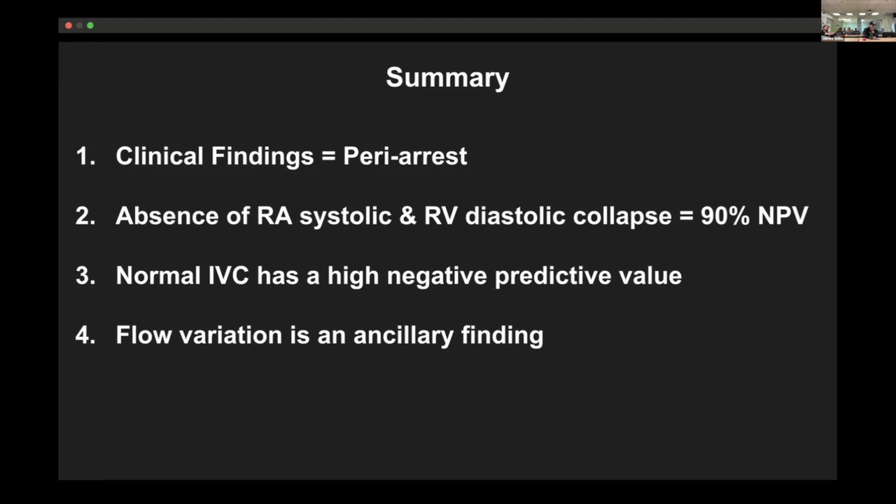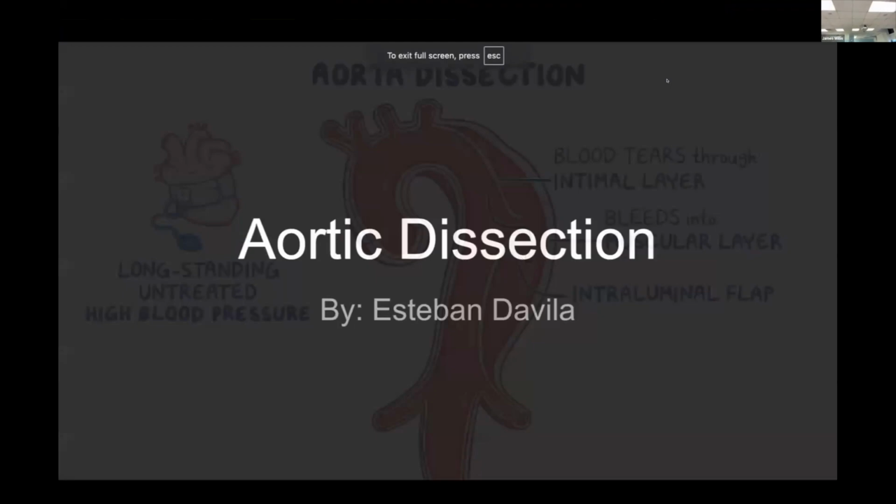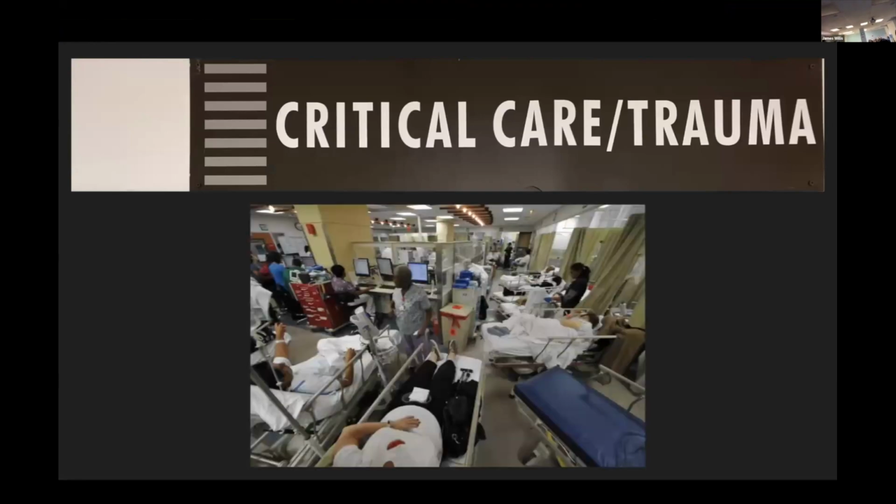All right, cool. This one's going to be mostly on here. We're going to be talking about aortic dissection and ultrasound, okay? This one mostly, you need to see the video, so we're just going to do it all here. So picture this, you're on CCT, room's a little busy, as it always is, all right?